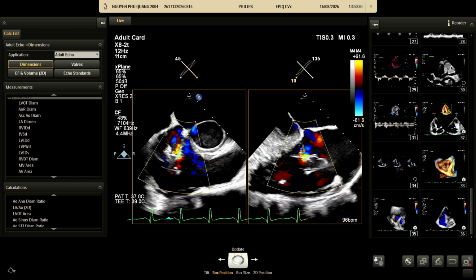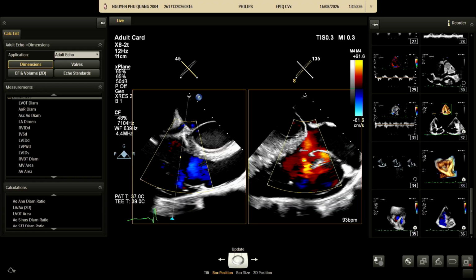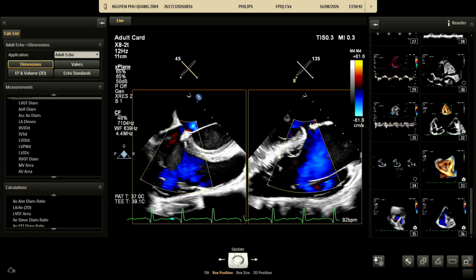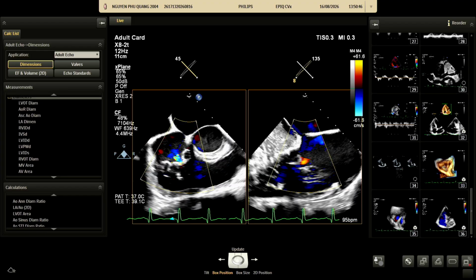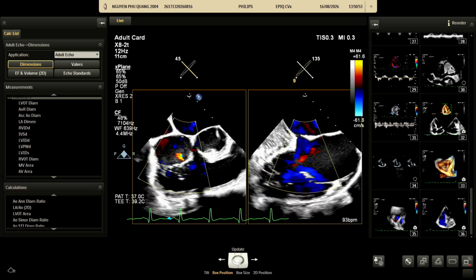Yeah, it's right in the middle. It's very central. Correct. Yeah, this is septal. The septal leaflet. We need to take a closer look at the septal leaflet. You see the jet coming through.